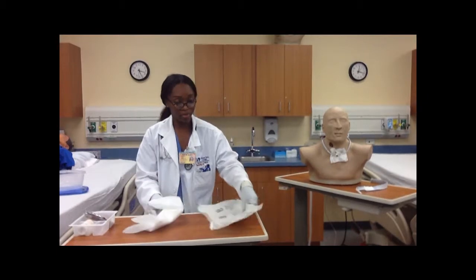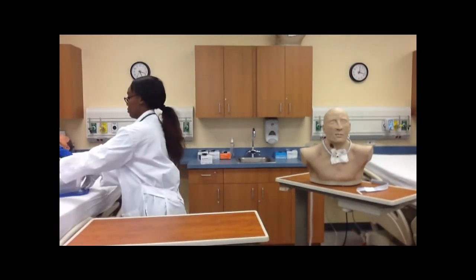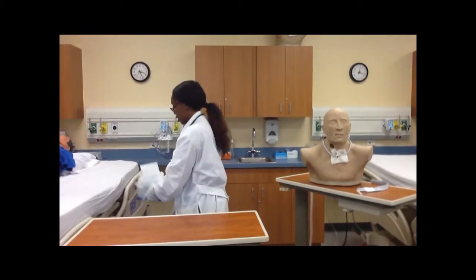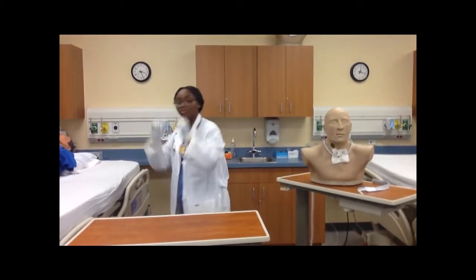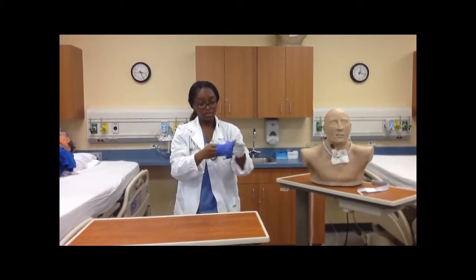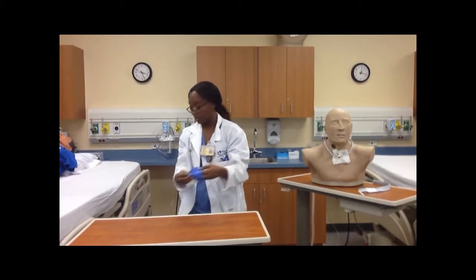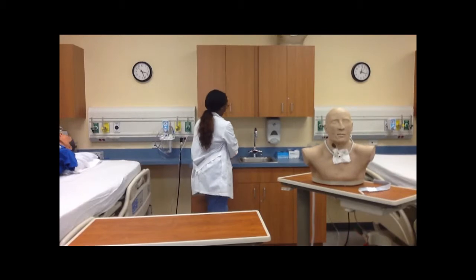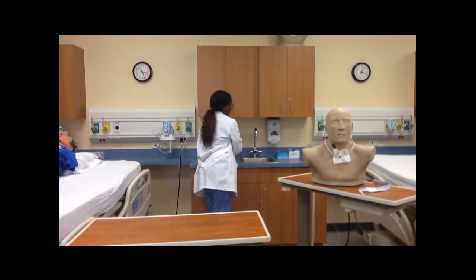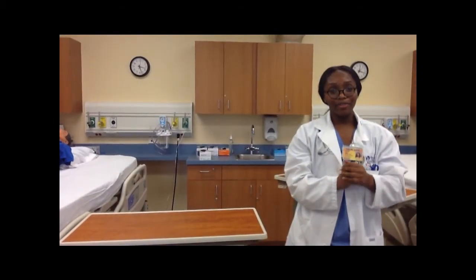Pack up all the equipment. Discard of it. Make sure I remove my gloves, and wash my hands prior to leaving the room, for 15 seconds.